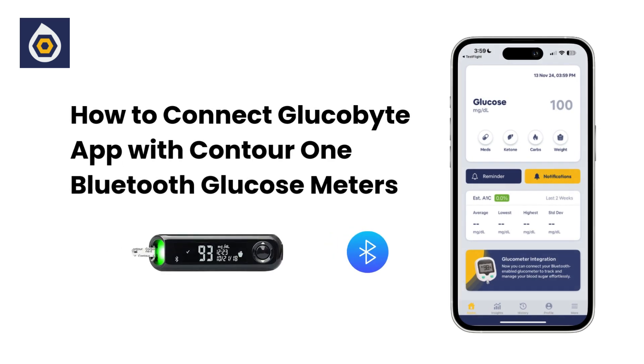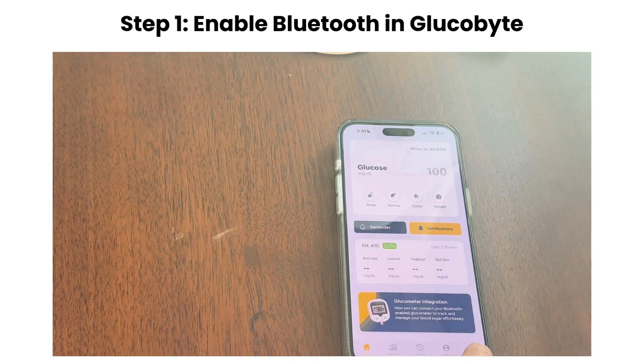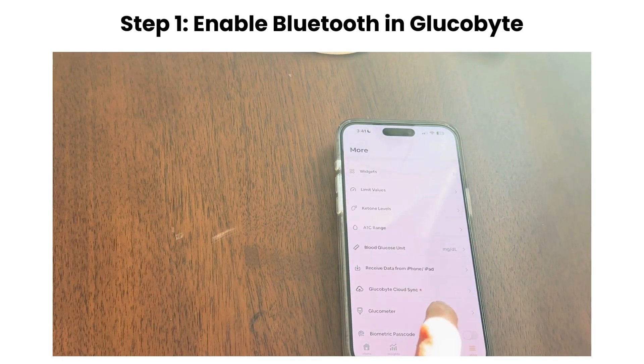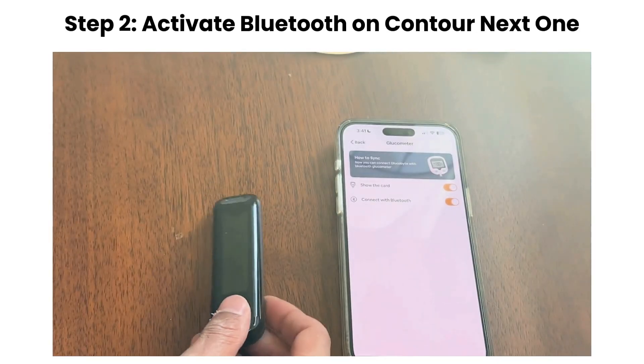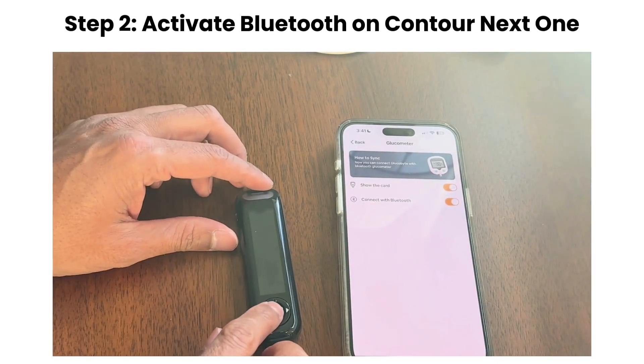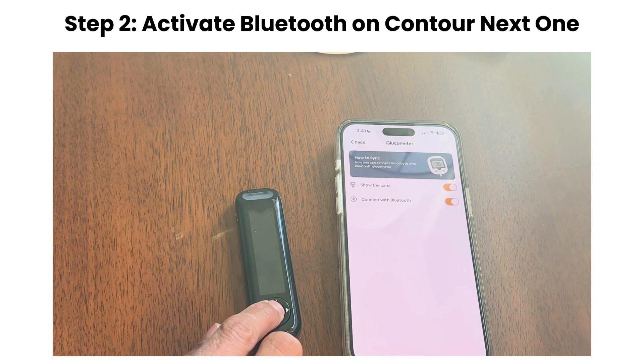First, let's connect the Contour Next One glucose meter. In the Glucobyte app, head to the More section and ensure Bluetooth is enabled. You may need to grant any necessary permissions to allow the connection. On your Contour Next One, press and hold the button until you see the blue light flashing. This means the device is in pairing mode.